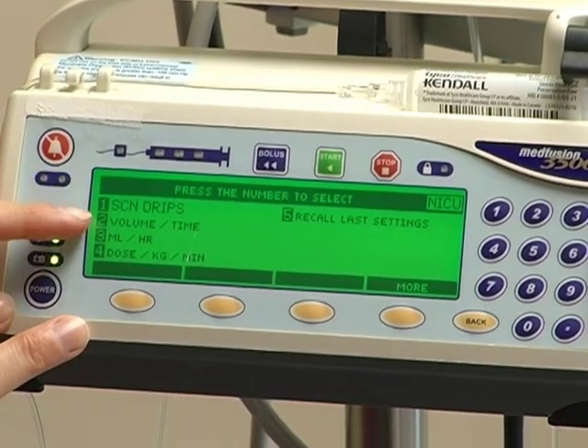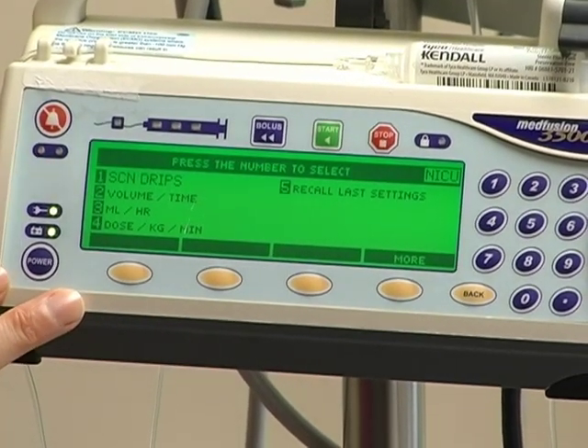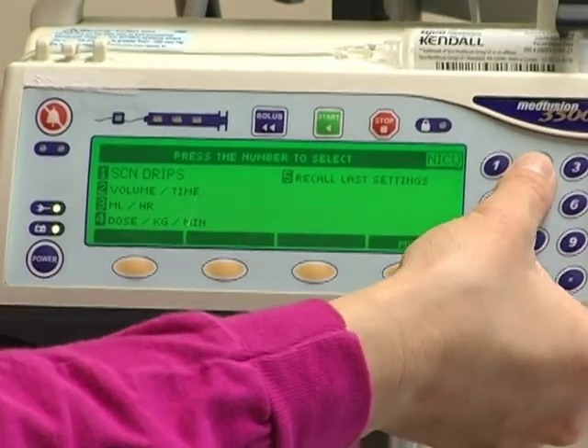So when you decide which option you need — usually here on Pediatrics we use volume over time for delivery of our antibiotics — you just select the number that corresponds with that setting. So you're going to just press 2.